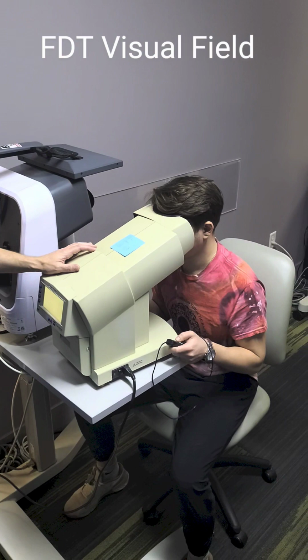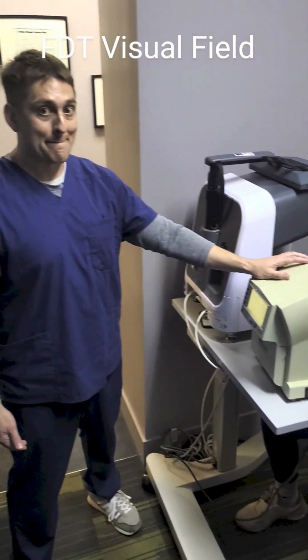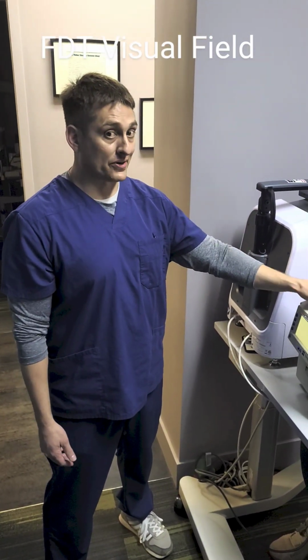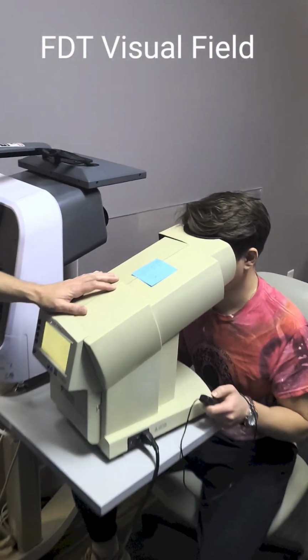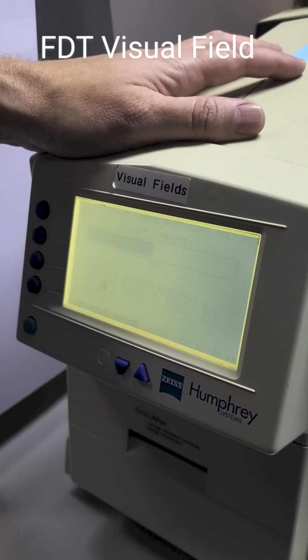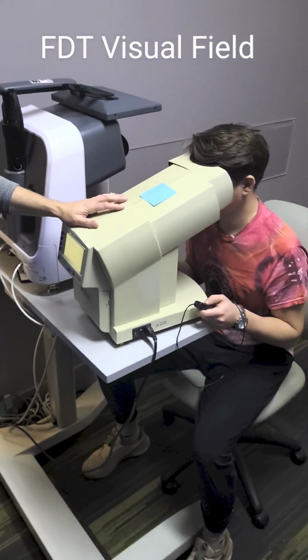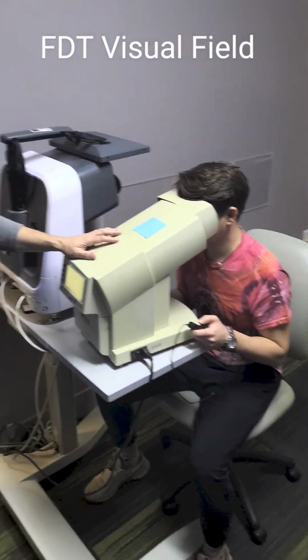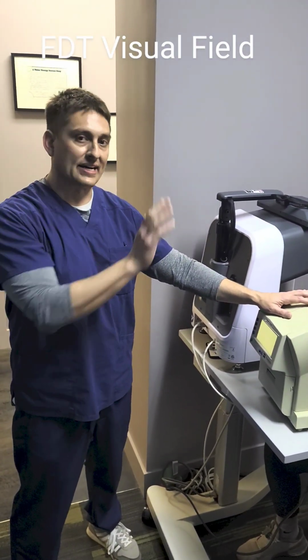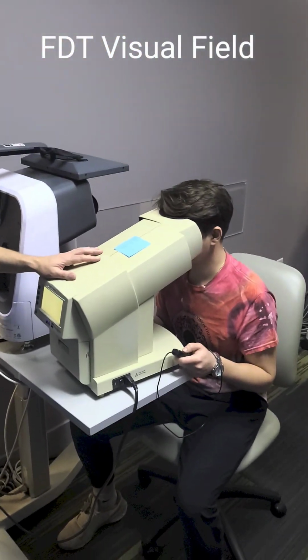Instruct the patient that the test has begun and that they should hit the button the same way they did with the right eye. As they proceed through the test, you can monitor their progress, encourage them to adhere to your instructions. And recall that they need to keep their eye on the center black square and only hit the button when they see the flashing, flickering white and black lines, so that we can get an accurate measurement of their visual field.